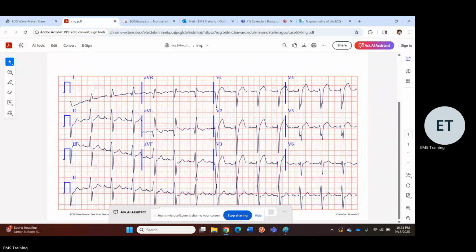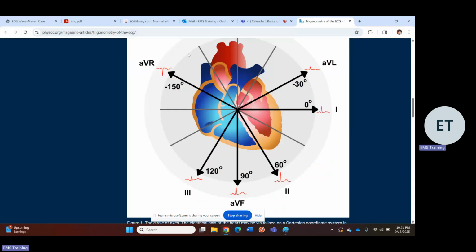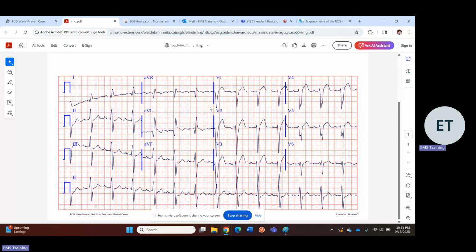And then let's look at this right here. This is pointing down, down, down, down, down, down. There's no R wave transition. This is absent R wave progression. This is abnormal. So by the time the beat gets down here to V5, V6, it's still going away. If all the beats go away, I start thinking VTach. So right away, this is an abnormal EKG.